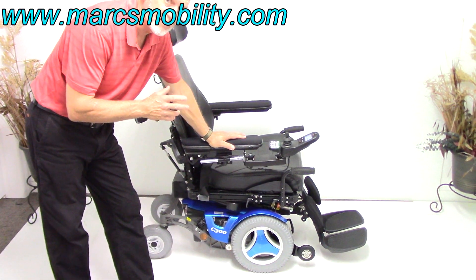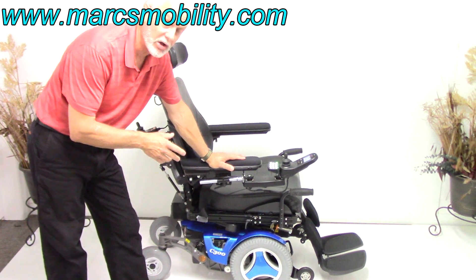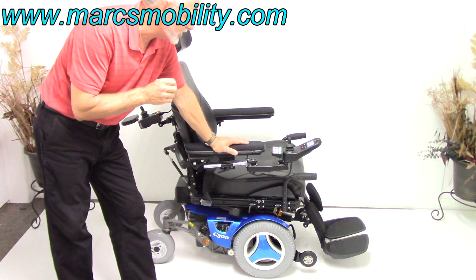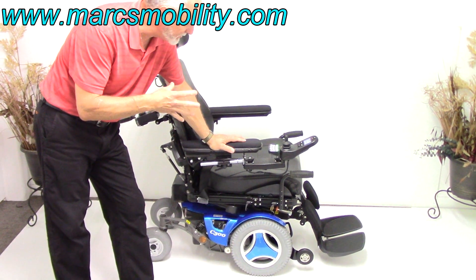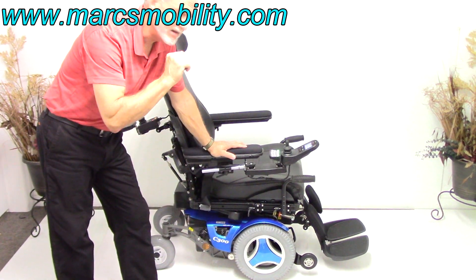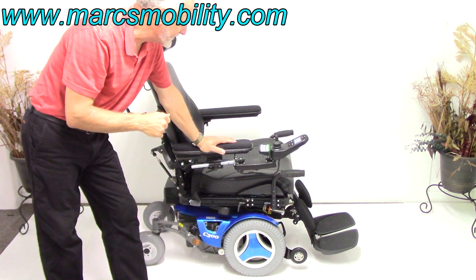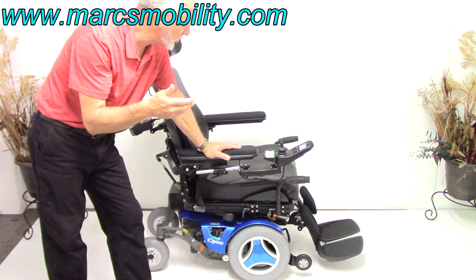This is a Permobil C300 front wheel drive power chair, beautiful blue color. This power chair only has 7 miles on it, so it's practically brand new. 7 miles, fully loaded — it has the 8-inch seat lift, the electric tilt, the electric recline, the electric legs, gel arms, and all kinds of features which we'll cover as we go along.